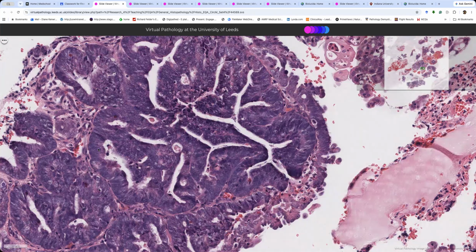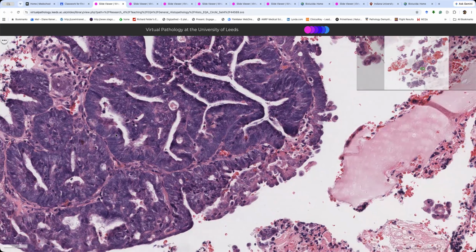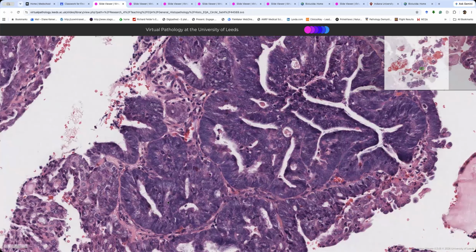Here we go. So here we have these things. Do we think that these are small and square, or do we think these are shaped a bit like a kumara? So, right, kumara. We have some kumaras. We have some cigar shaped. Yes, cigar shaped. So these are more elongated.